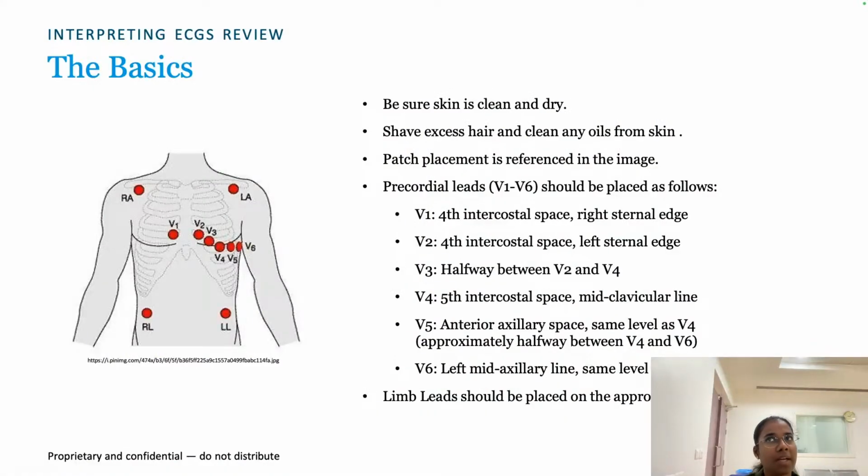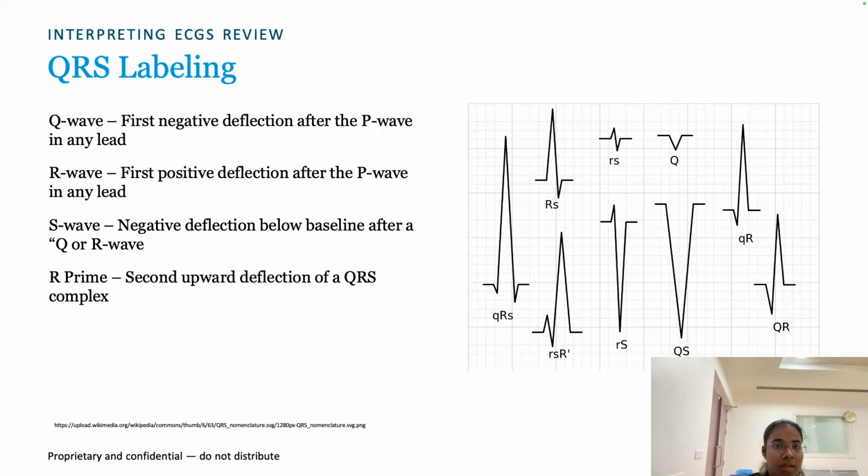In ECG, it is a normal 12-lead ECG setup in a non-EP setup. If it is in an EP setup, we can place our bundle catheter in the bundle, and we can focus mainly on V1, which is covering the conduction system of the septal region of the heart. We have limb leads and precordial leads from V1 to V6. We should very carefully place V1 in the right area where the conduction system lies, in the fourth intercostal space.